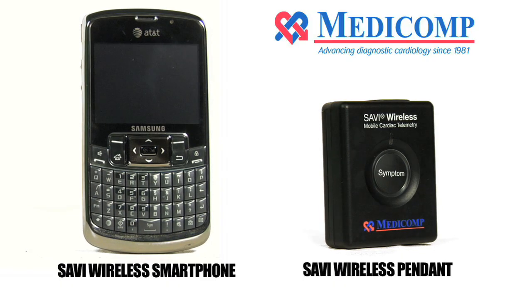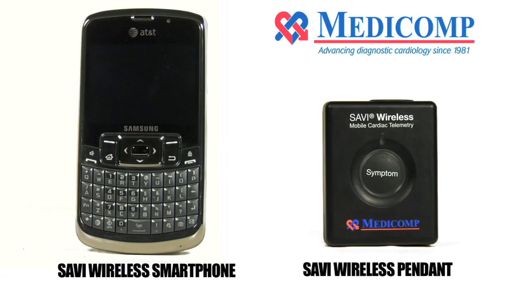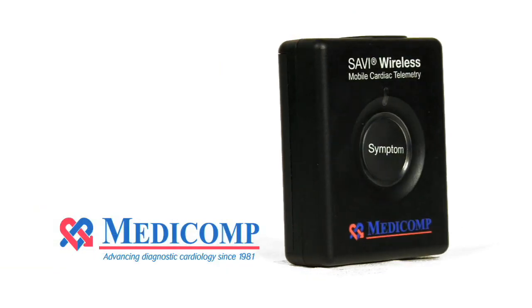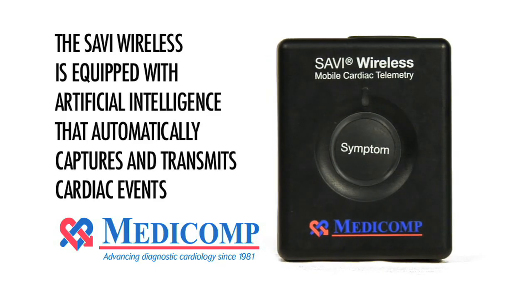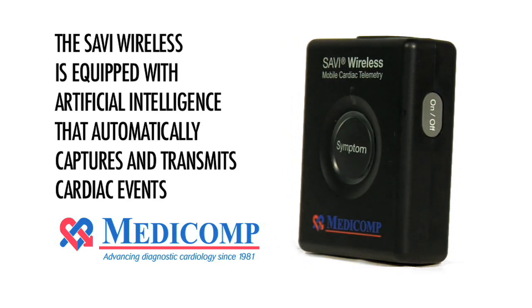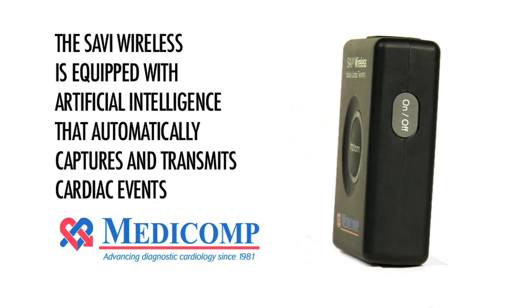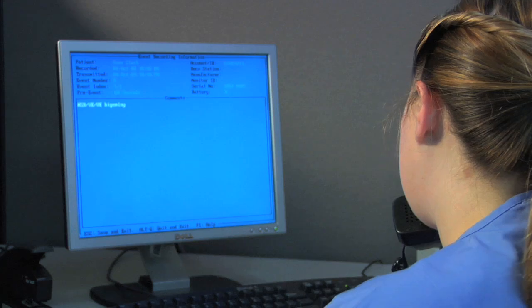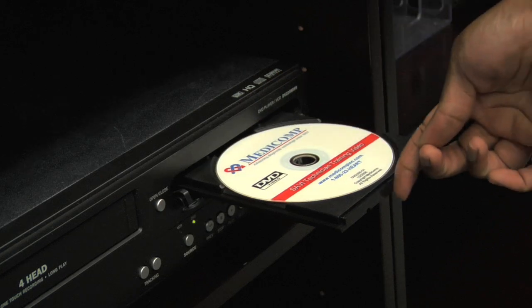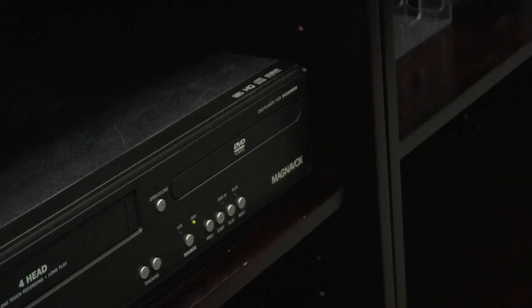Your doctor has prescribed the Savvy Wireless monitoring procedure and entrusted Medicom to help identify any possible cardiac arrhythmias. The Savvy Wireless monitor you'll be using during the next 30 days is equipped with artificial intelligence that can automatically capture and transmit cardiac events via the cellular network to Medicom's Cardiac Monitoring Center. This video provides all the information you need for proper use and handling of the monitor during your testing period.